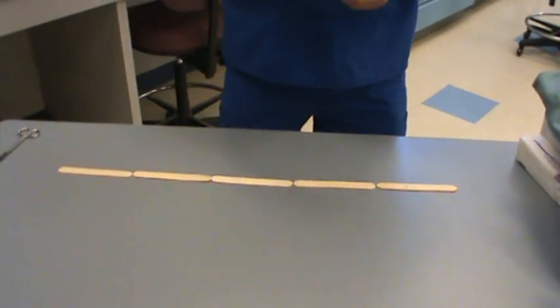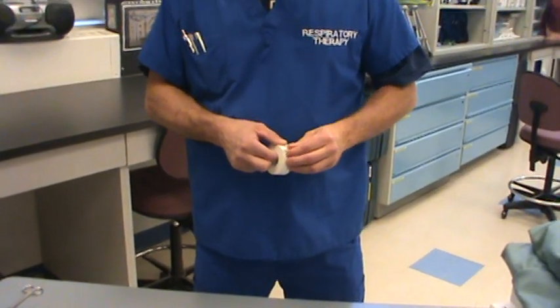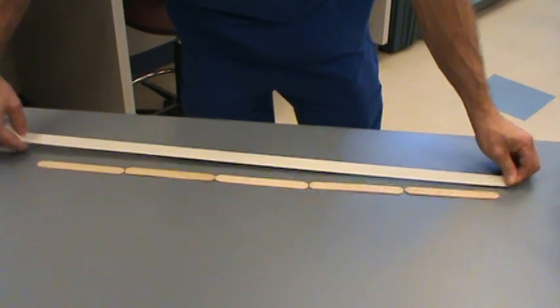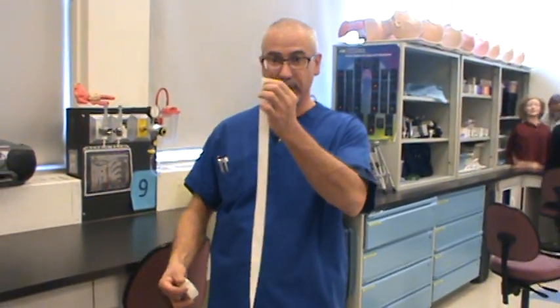Next thing, grab your tape and tear off a bit of tape that would be the exact same length as your tongue depressors that you have strung out. So roughly about that long. You can cut the tapes with your scissors or rip them off with your fingers.